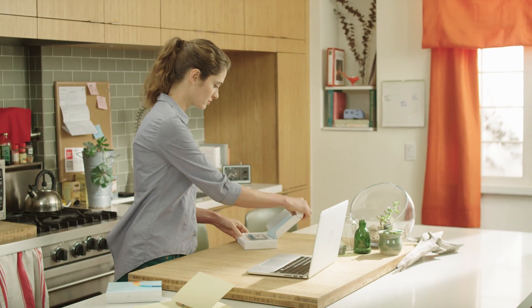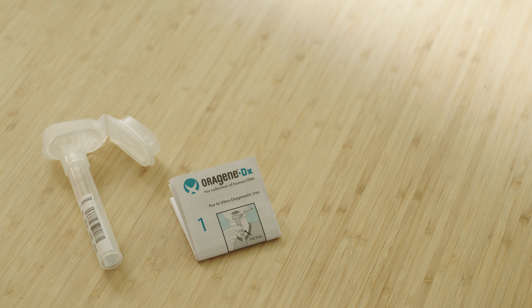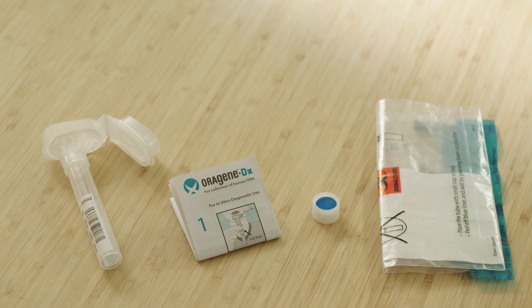Here's what you'll find in your kit: a saliva tube, detailed instructions, a blue cap, and a plastic bag. Make sure to save the cardboard box so you can return your saliva sample to Color.